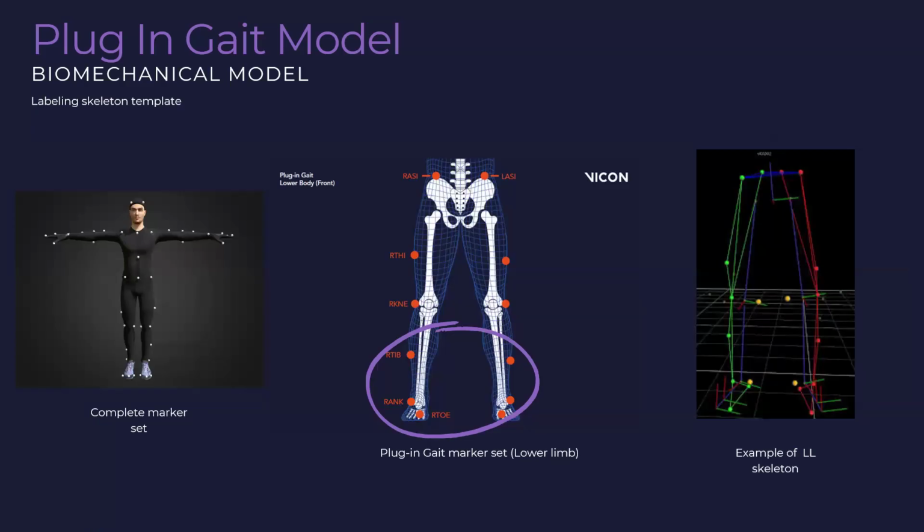Like doing the signal alignments. In your experiments, we have a unified data acquisition system. Even when we apply perturbation in virtual reality, we take another wire that goes into the data acquisition system. So when we start recording, everything is synchronized with the same timestamp and with the same system. Yes, I didn't think about wiring the exo to the system.